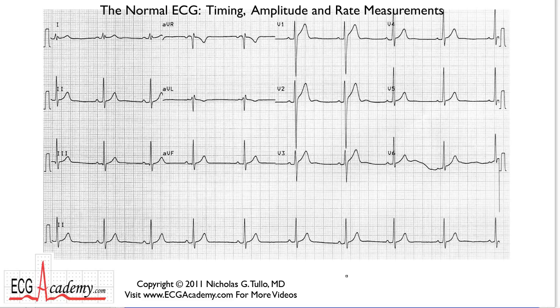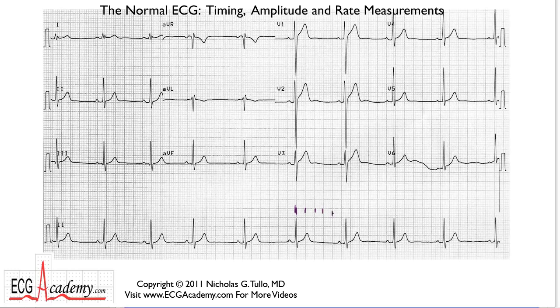We're going to go back to this 12-lead tracing of that 18-year-old person and get a sense of how to measure rate on a 12-lead. You have to scan around and look for a QRS complex that lands on a heavy line. Counting off: 300, 150, 100, 75, 60, 50 — so if this is 60 and this is 50, you'd call it about 55. And that's what we came up with in the mathematical calculation.